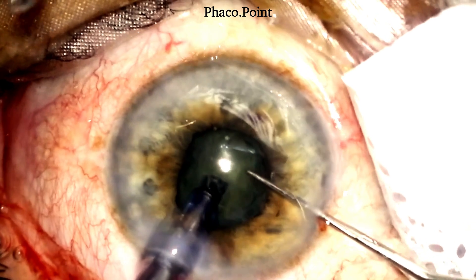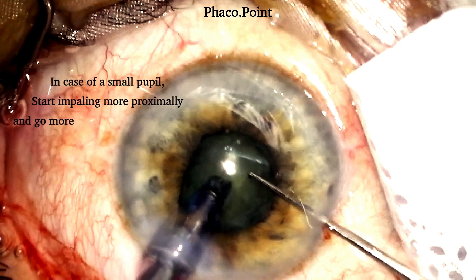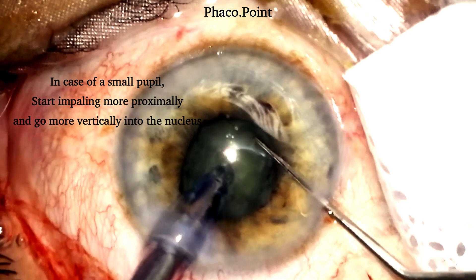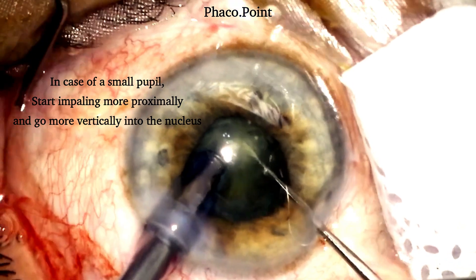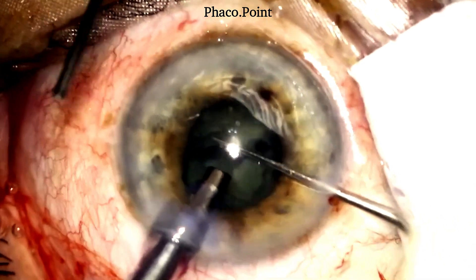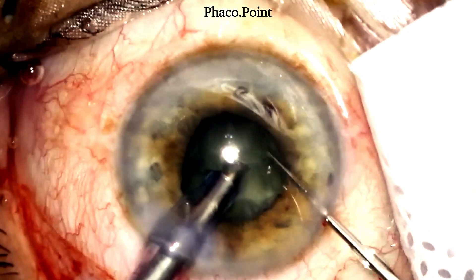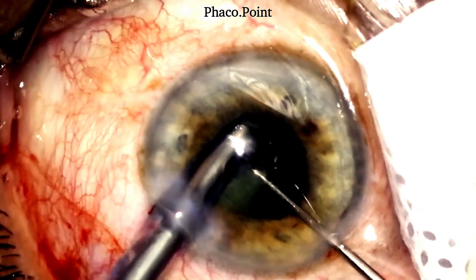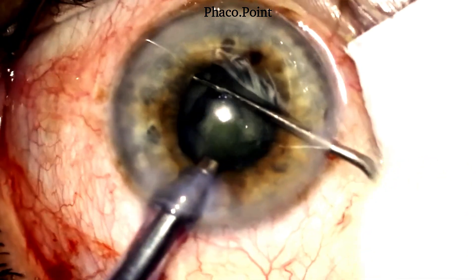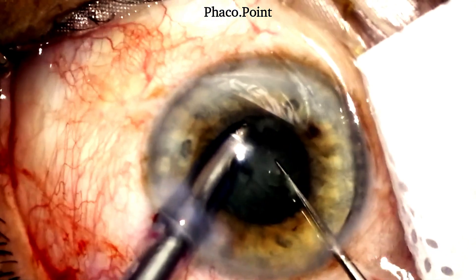With the chopper held in the non-dominant hand to hold the eye stable, the phaco probe now impales into the central part of the nucleus. What's different in a small pupil is that you need to go slightly more vertically downwards and perhaps start slightly more proximally to adequately reach the correct depth and thereby successfully chop the nucleus. With the first chop being successful, we now have adequate visibility into the depth of the nucleus.